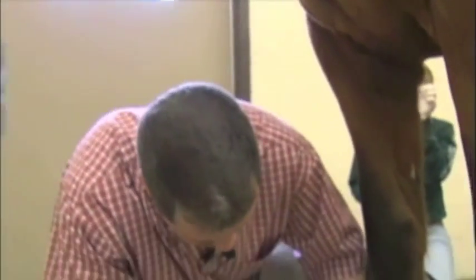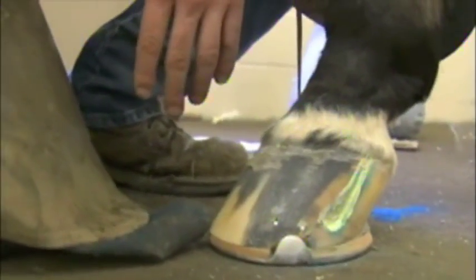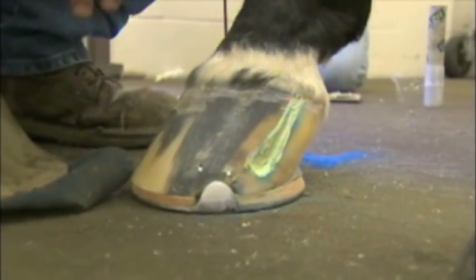We're going to patch the quarter crack on this horse's foot. First we shod him with a shoe with frog support, but as far as using the Equilox to patch a quarter crack, preparation of the crack is probably the most important first step.